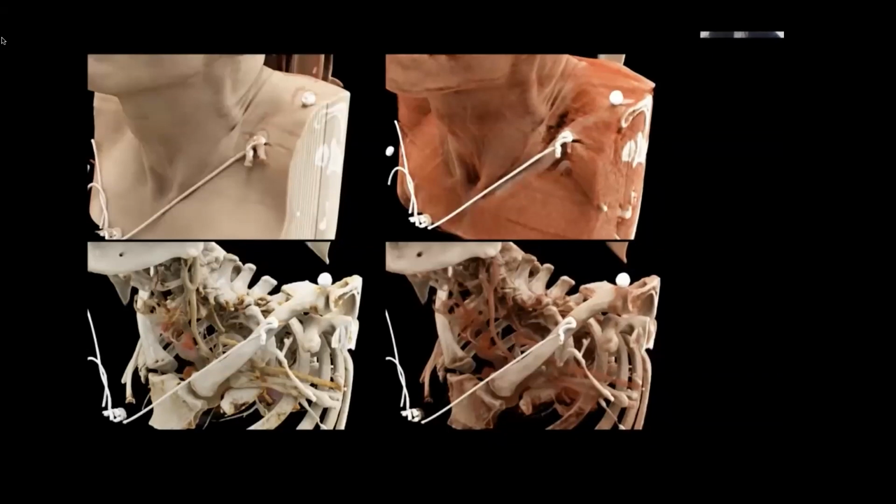Now, each of those individual small little blocks that make up this large volume of tissue can be looked at in various ways. Traditionally, when you look at a CT scan, you're not actually looking directly at the tissue, and it's important to always bear that in mind. You're looking at a computer algorithm's depiction of the tissue, right?